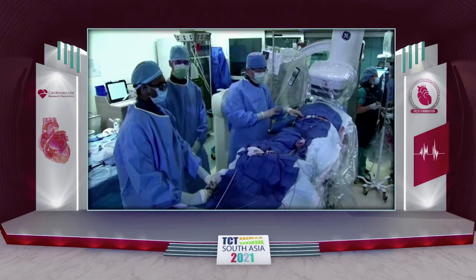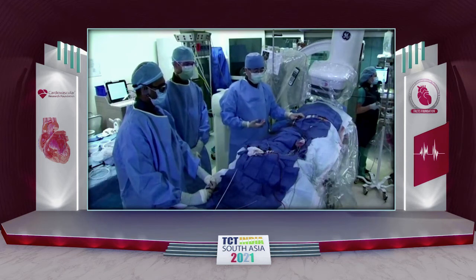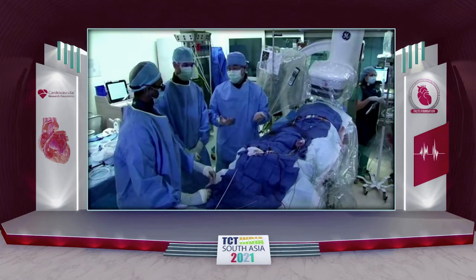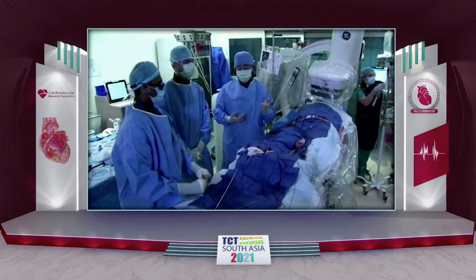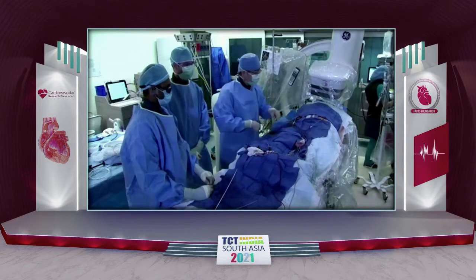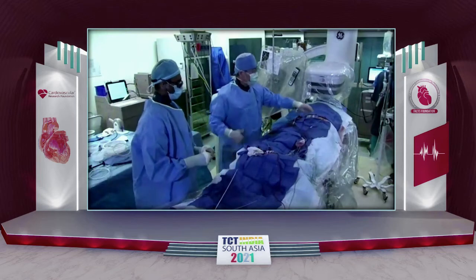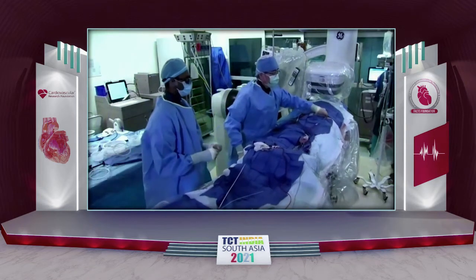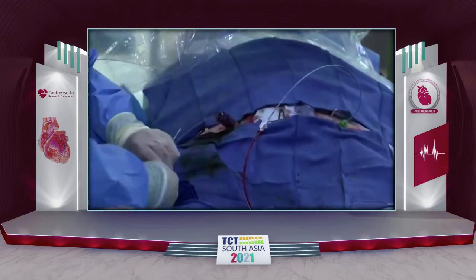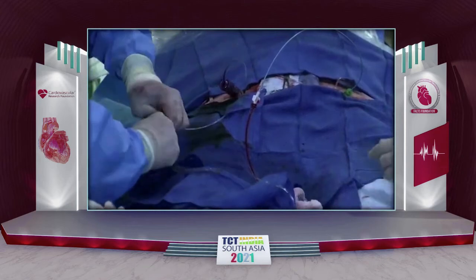It stops the bleeding. And depending on which size of sheath we need, we may either pick up doing the angio, or do one more Perclose, or decide to go for the protamine and manual hold of the groin. So we usually routinely do these things with the rim catheter up and over. We're just gonna take this out and leave the 035 wire in there. It's a little bit hard.